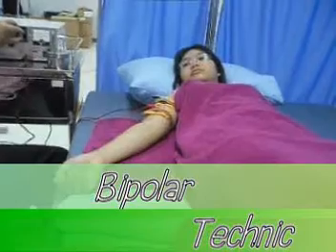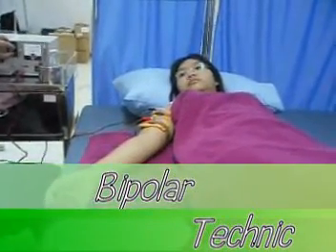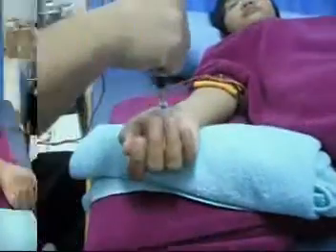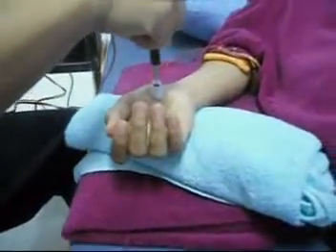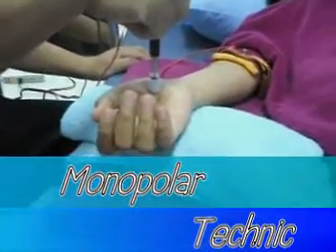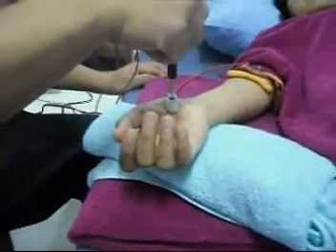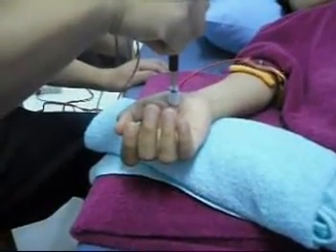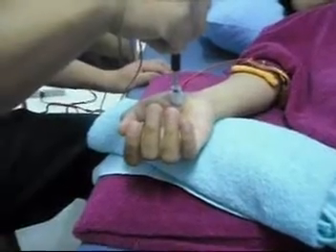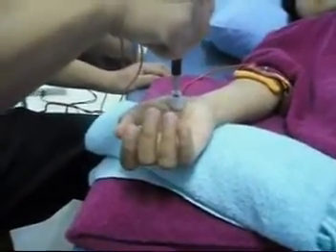Technique 1, bipolar technique, covers the muscle belly that you want to stimulate. 2. Monopolar technique, move the active electrode over the muscle fiber, pressed only on the motor point, and the dispersive electrode is pressed far away.